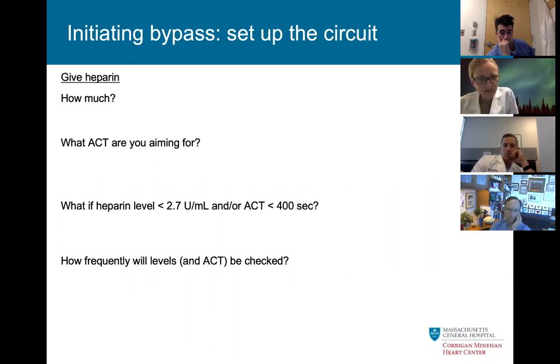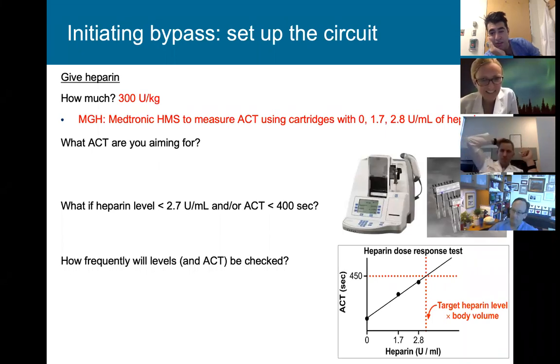Is Andrew Baldwin on here? How much heparin do you give when you're telling anesthesia and perfusion to give heparin? I can answer for Andrew since I'm his equivalent level. Typically the dose is 300 units per kilogram. The perfusionists have a fancy calculation that takes a couple of other things into account, but that's the rough guide.